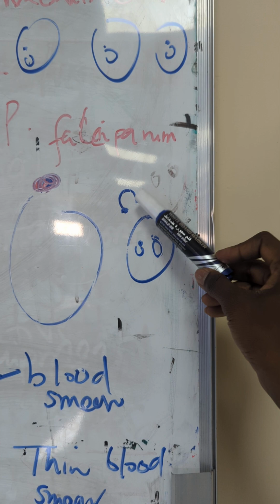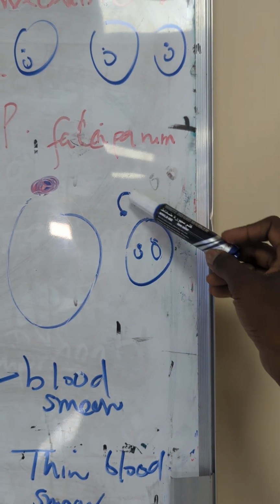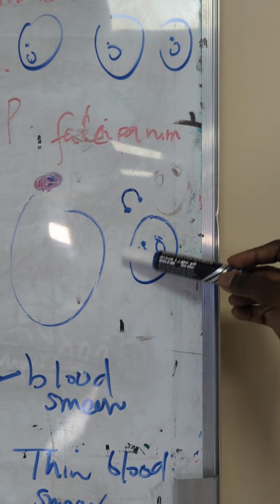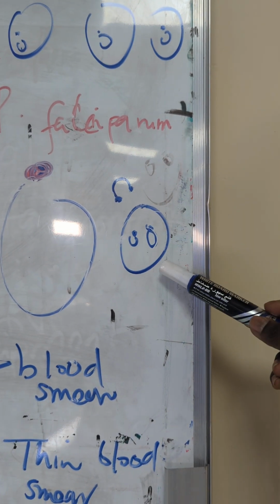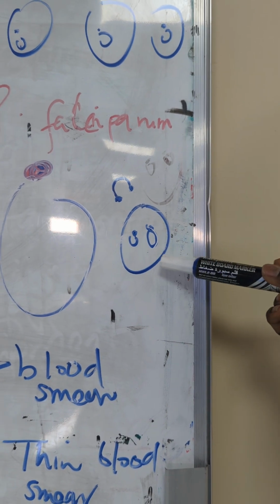And then we also mentioned that the presentation, which is very characteristic of falciparum trophozoites, can also have a headphone appearance with the double chromatin dot, or sometimes multiple infection in an infected red blood cell.